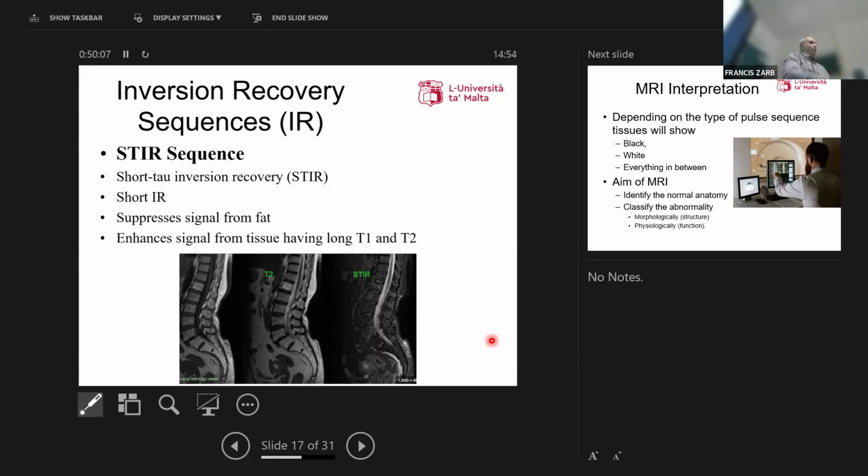Fil-fatt għalhekk inti jkollok different protocols u fl-MRI aħna mhux bħas-CT. CT għandek CT abdomen u daqshekk. Protokoll wieħed mhux qed ngħidlek protokoll wieħed għal kollox, le. Imma jekk inti pereżempju qed tagħmel brain, jekk inti għandek you're suspecting multiple sclerosis, is-sequences ħajkunu differenti minn protokoll ta' tumor għax ċertu sekwenzi se joħorġu dik il-patoloġija aħjar minn l-oħra. Allura jkollok different protocols, jiddependi based on the clinical indication.